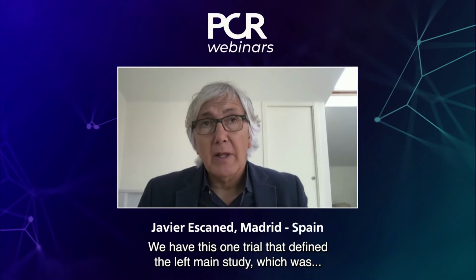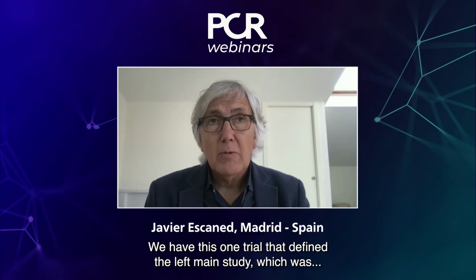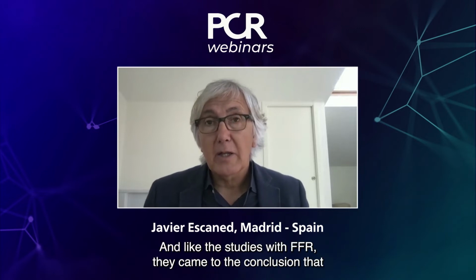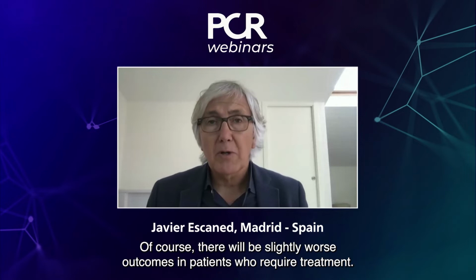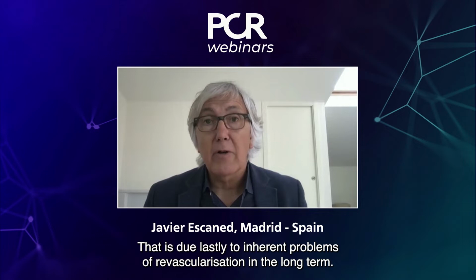Finally, as Robert Jan has said, we have at least one trial that is the DEFINE LEFT MAIN study, which was studying about 300 and something patients who were either treated based on iFR or deferred based on iFR. And like the studies with FFR, they came with the conclusion that patients have similar outcomes. Of course, always slightly worse outcomes in patients who require treatment. But that is obviously due largely to the inherent problems of revascularization in the long term.